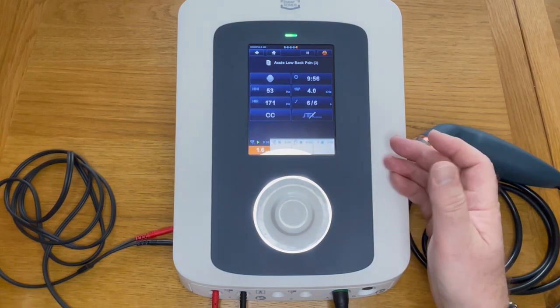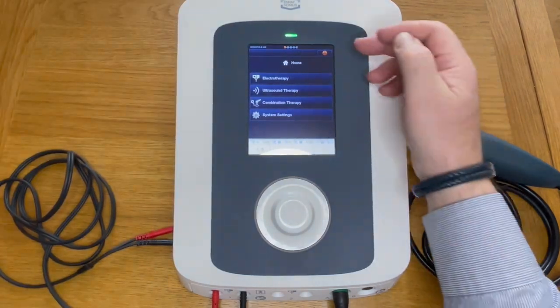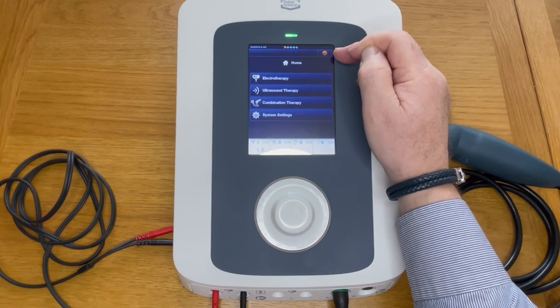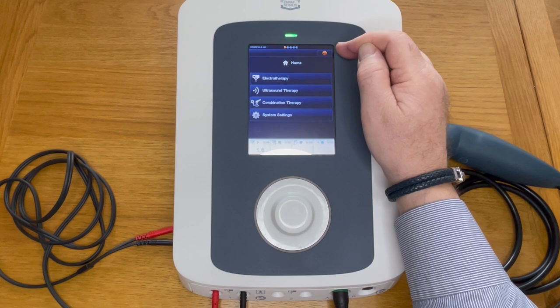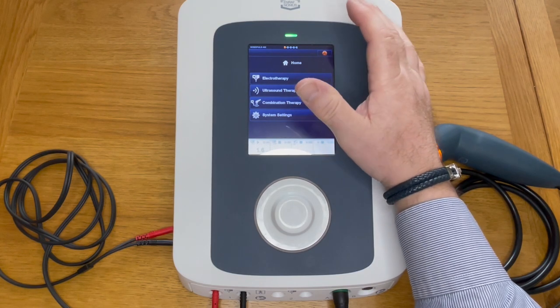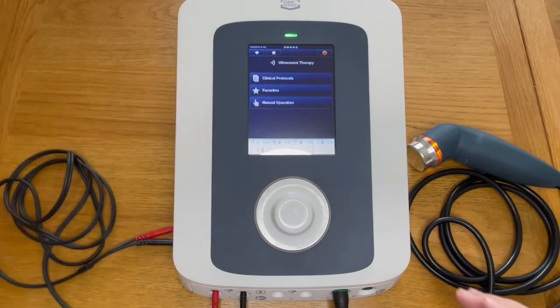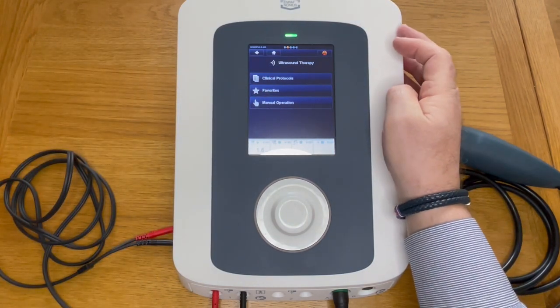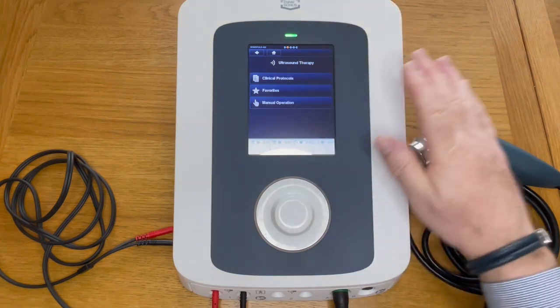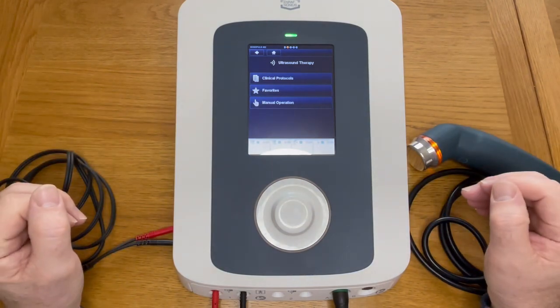Once happy, press the current button and increase the intensity. When finished, you can press home — but notice that this button is still illuminated, meaning the current is still operating and the frequency is still running. If you wish to now go to ultrasound, you can select it but you can't do anything because the electrotherapy is still operational. To stop it completely, press that stop button, which stops all output from the machine.